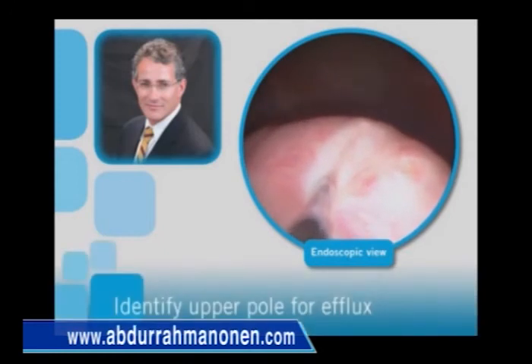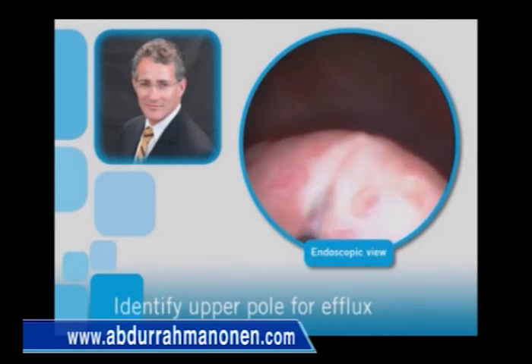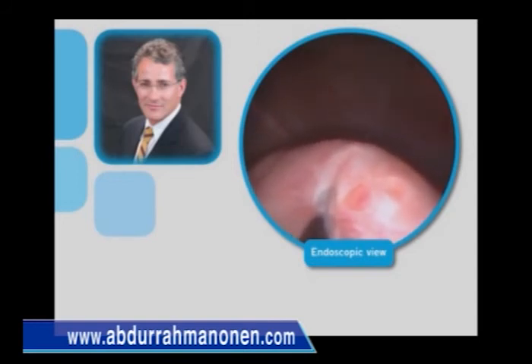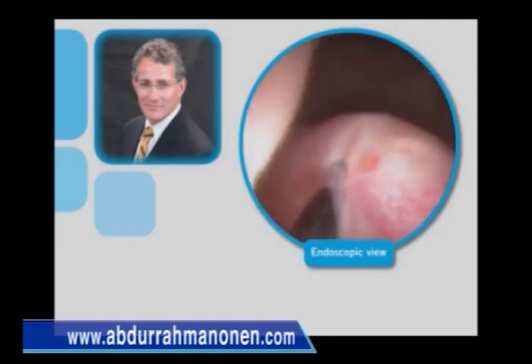It's important to identify the upper pole orifice for efflux of product, as penetration through the lower pole ureter may lead to penetration of the upper pole ureter within the common Waldeyer sheath. If this occurs, the needle needs to be backed out, or a new injection site needs to be utilized. The surgeon will feel very subtle changes in the pressure buildup as injection proceeds, and these will also provide subtle clues for the end point of injection.